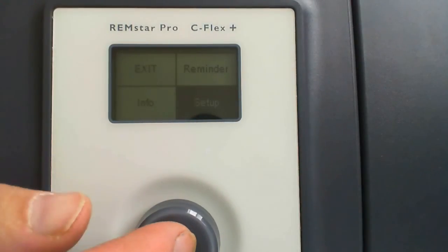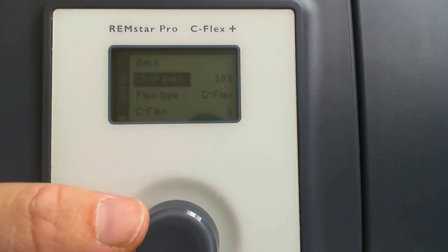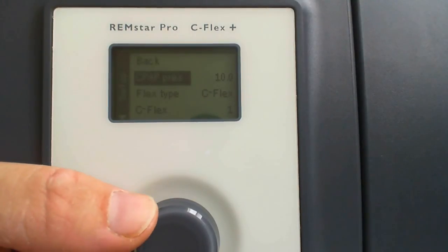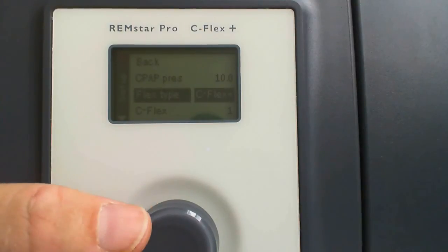So here we go into the setup menu. This is the heart of this, and I'm moving pretty quick so it doesn't time out. But here, of course, you have your standard back button, CPAP press. That is to set your CPAP pressure. Like I said before, flex type, and I'm going to show you this. There's C-Flex, there's C-Flex Plus, and there is none.